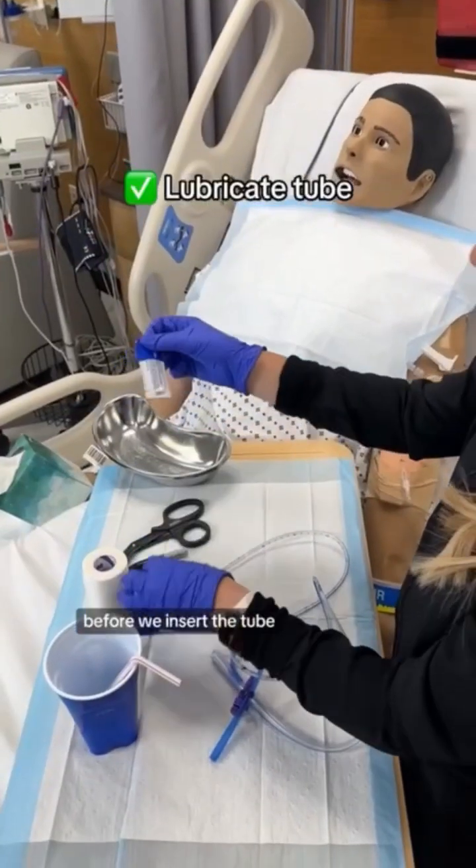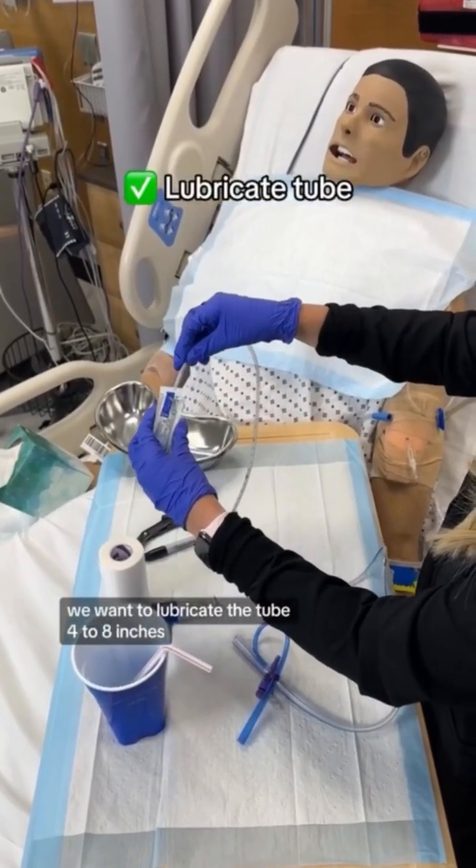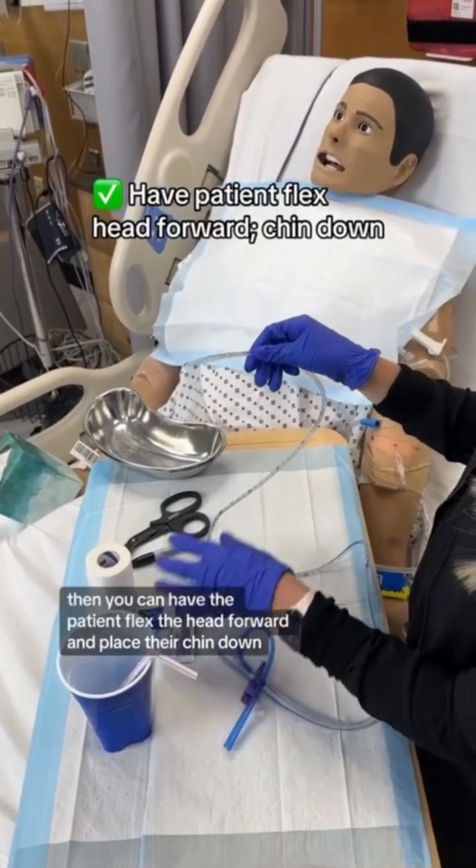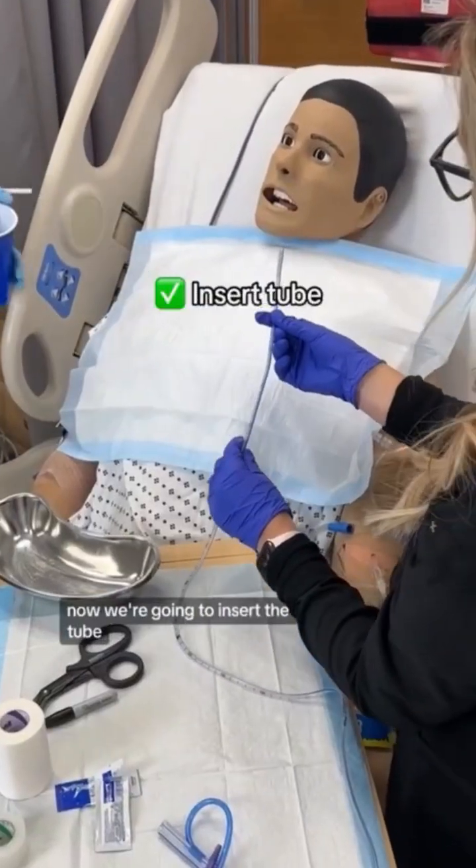Before we insert the tube, we want to lubricate the tube four to eight inches. Then you can have the patient flex the head forward and place their chin down. Now we're going to insert the tube.